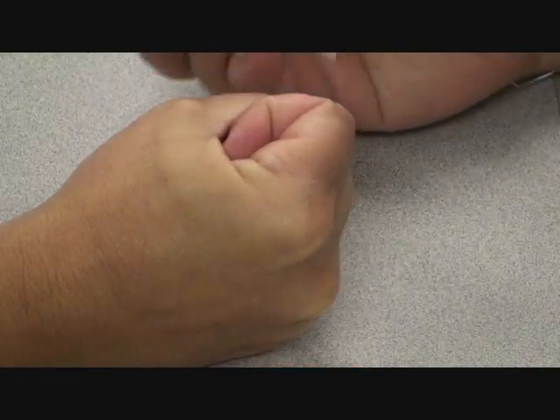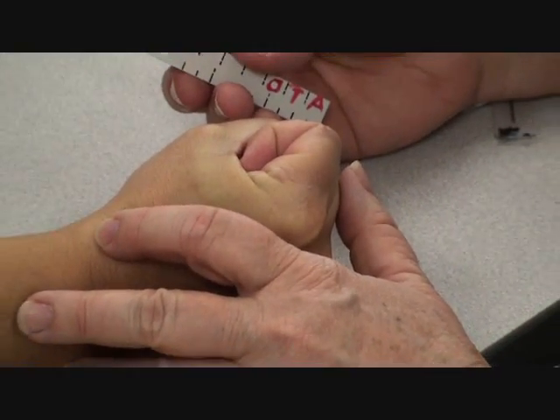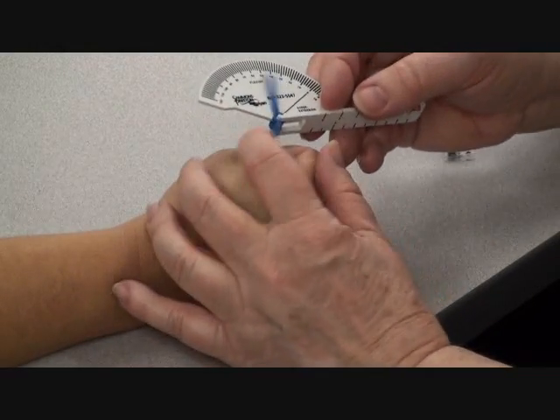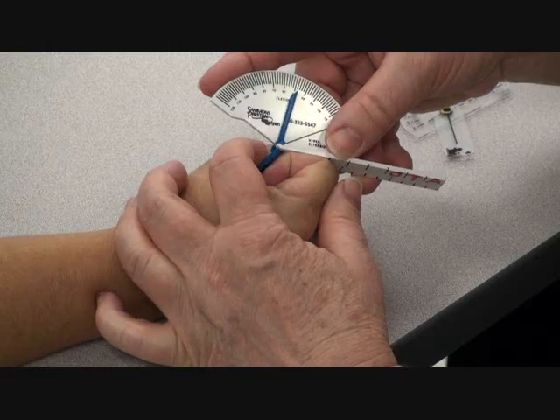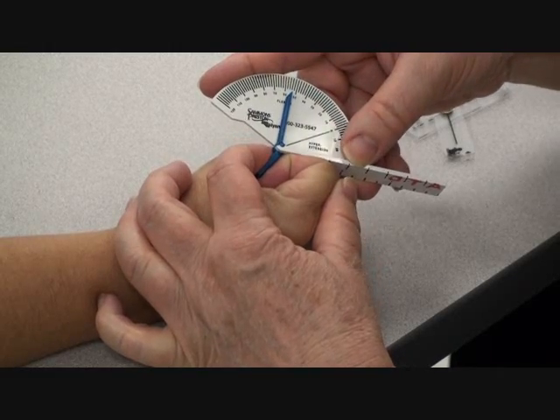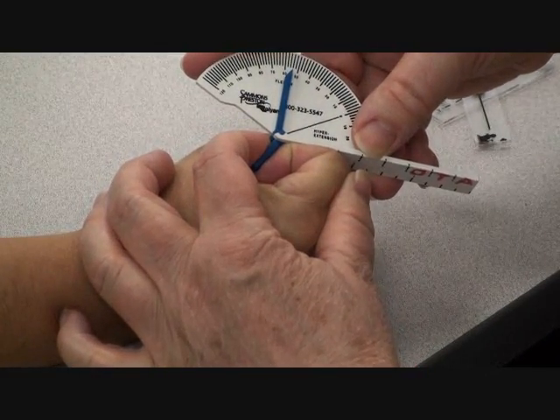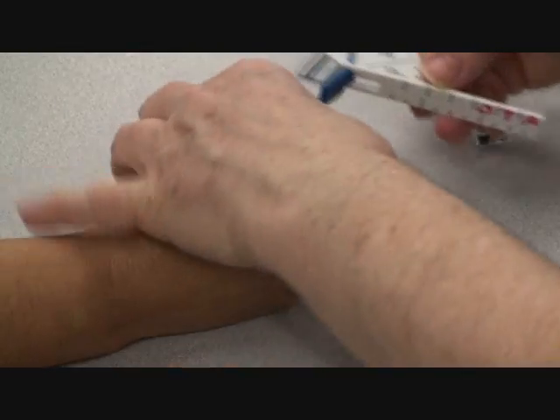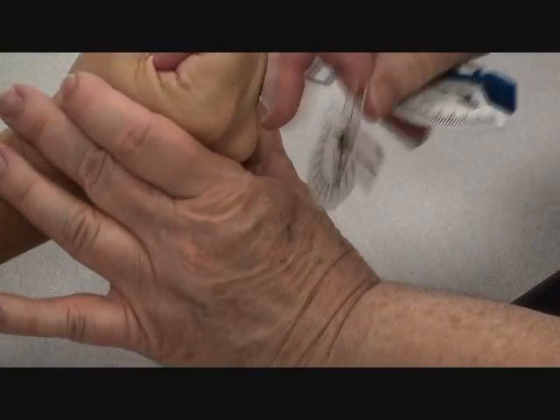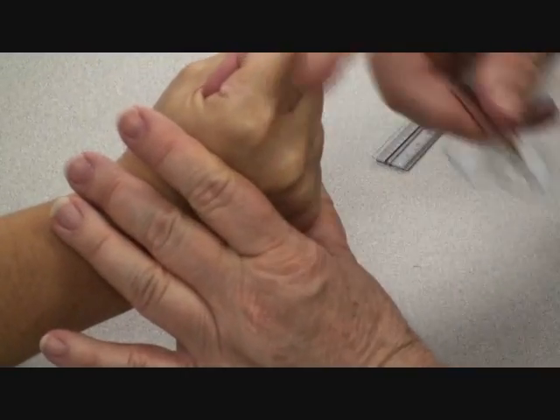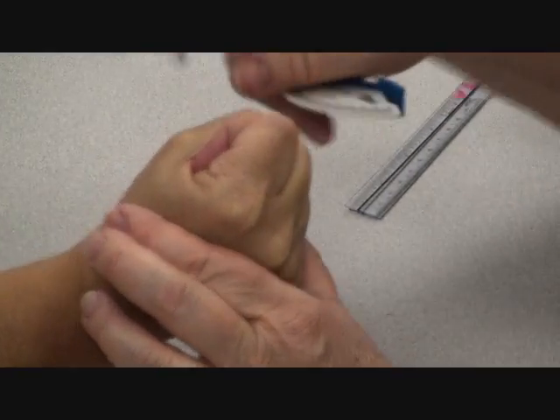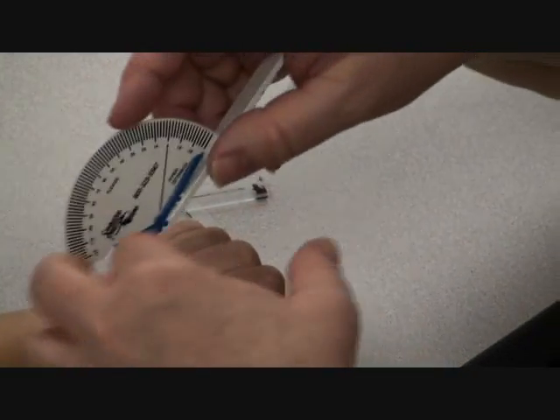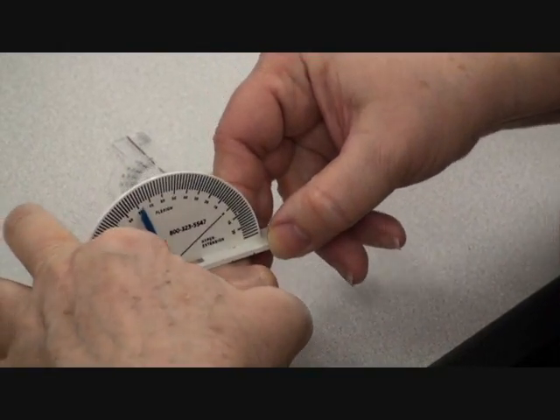Or we could use this, which we're not using except for the DPs because we were coming off, in some cases, 10 or 15 degrees off. So not a good tool for us here. So I got about 56 using this. But this is our way that we could measure over the top and get our MPs and our IPs with our cutoff goniometer. But if we wanted to get our DPs and still do our composite measures, we can come in here and use this.